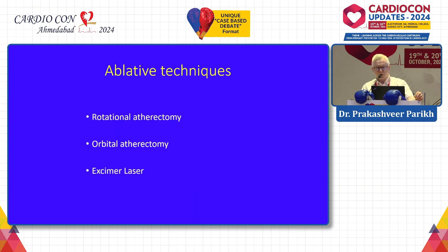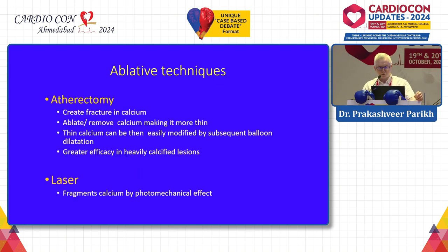While the ablative techniques in general include rotational atherectomy, the new addition orbital atherectomy, and excimer laser. Atherectomy is effective for modifying the calcium. It will ablate or shave the calcium, making it thinner. This thin calcium can be easily modified by subsequent balloon dilatation. They have great efficacy in treating heavily calcified lesions, while the laser fragments the calcium by a photomechanical effect.